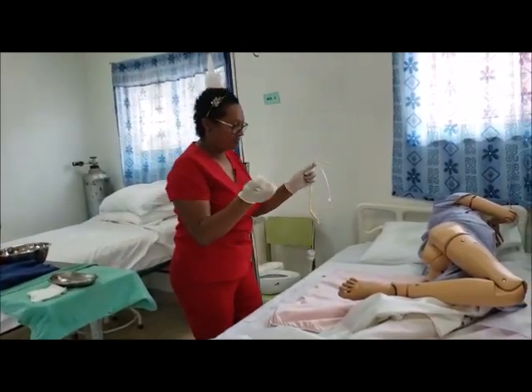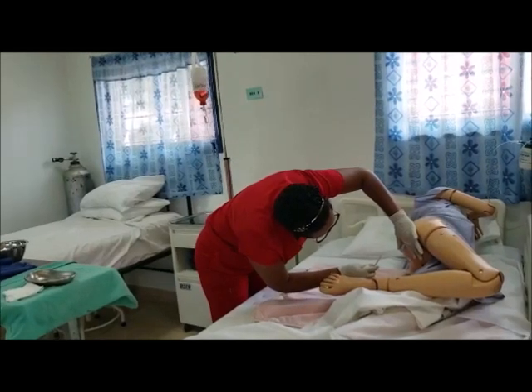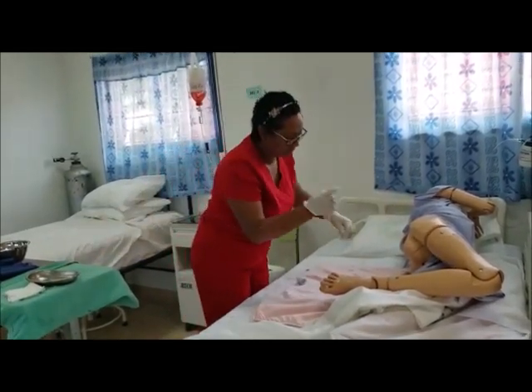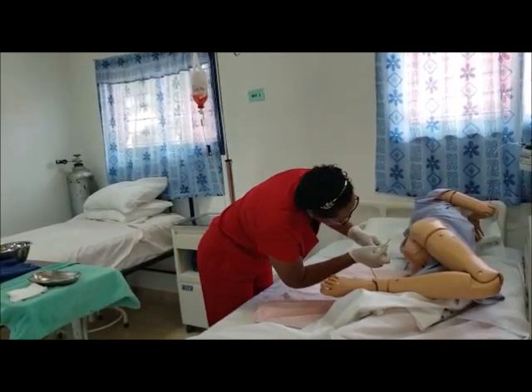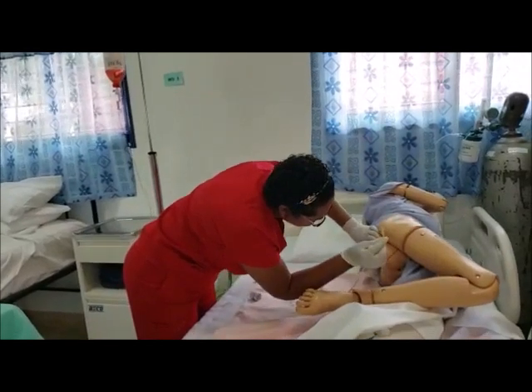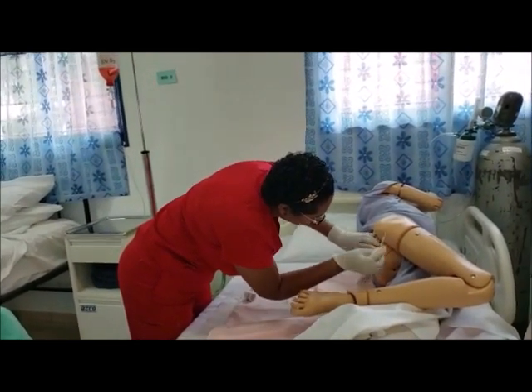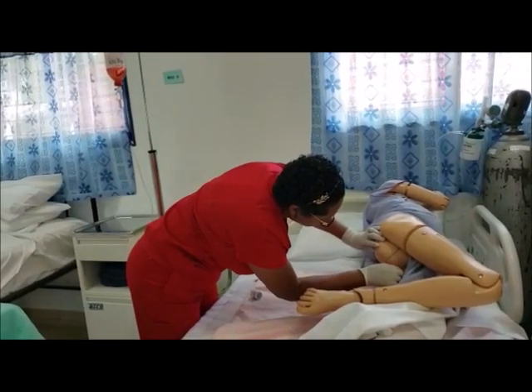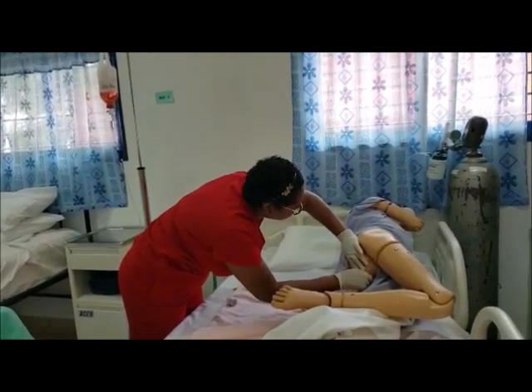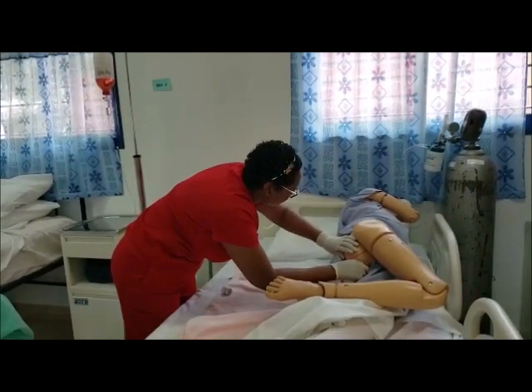Lift upper buttock to visualize the anus and lubricate the tubing. Insert the enema tube slowly into the anus, 3 to 4 inches toward the umbilicus. Do not force the tube into the anus. If resistance is met, ask the patient to take a deep breath and slowly run small amounts of solution into the anus. Please take a deep breath.